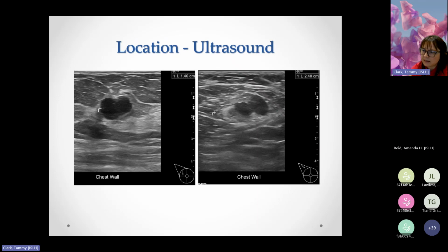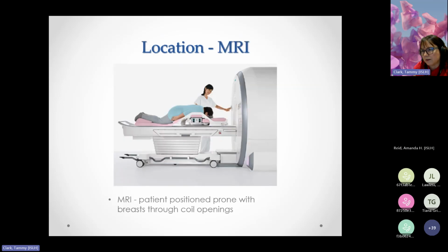And then here is the axilla. So we're assessing the breast lesion, but we're also going up to the axilla, and this does look like a suspicious lymph node where you can see that most of the fatty hilum has been eaten away by the cancer. So we went ahead and we biopsied this lesion, and it's probably multifocal disease with a right breast lesion.